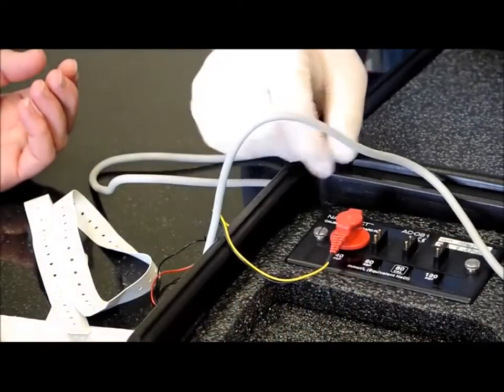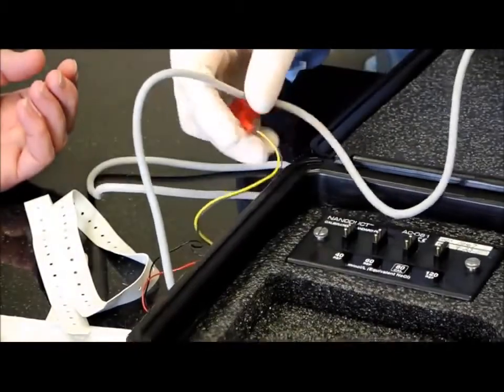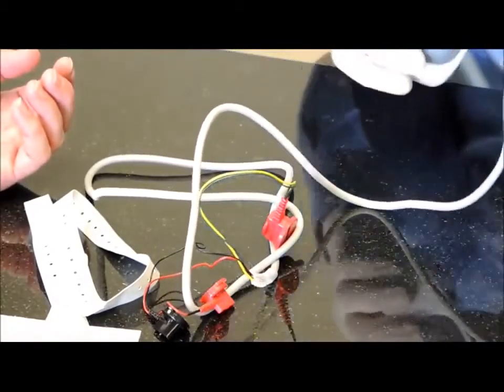Before you do the iontophoresis, you should make sure that the sensor is unplugged from the calibration plate, and you can move the Nanoduct and the case to the side, so the case is no longer in your way.